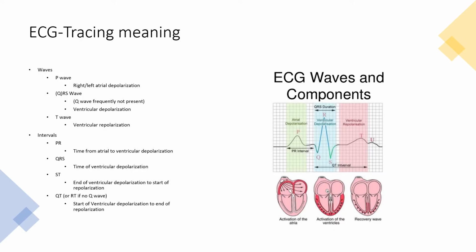Drugs that block potassium leaving the cell prolong the QT interval because they prolong ventricular repolarization. This predicts the likelihood of entering into a rhythm called torsades, and drugs that prolong the QT can increase your risk of torsades. So many pharmacists are charged with identifying drugs that might prolong the QT interval.